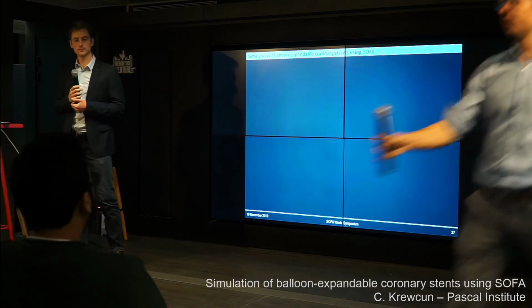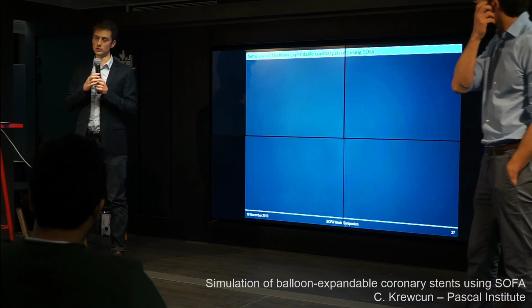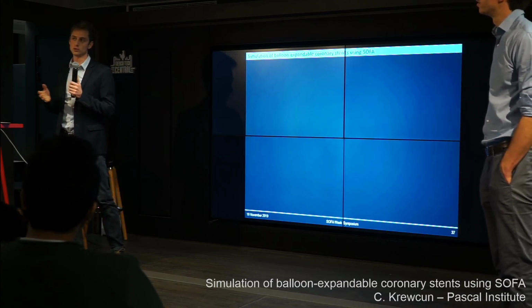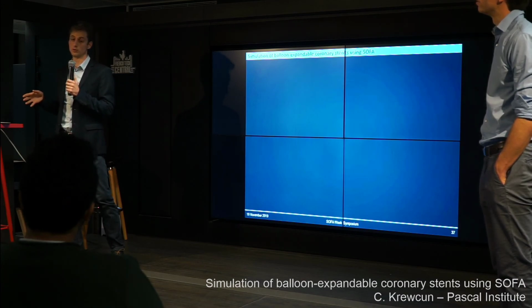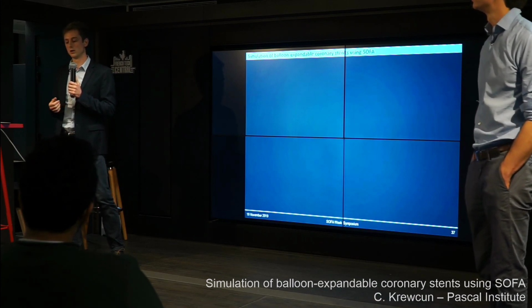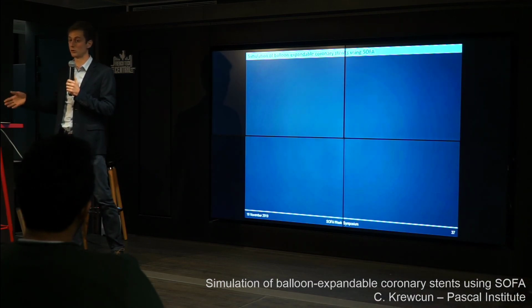Why OCT imaging for the validation instead of X-ray based? Actually, OCT images here are specific to cardiology. There are technologies which allow cardiologists to retrieve 2-dimensional images of the inside of the artery using OCT probes. The corresponding images are of a very high resolution, meaning that they are comparable to histologic images of sections of the artery. In Clermont-Ferrand, the physicians have an important base of these images of coronary arteries of real patients. What we'd like to do is to exploit the high resolution of these images to get the artery geometries.